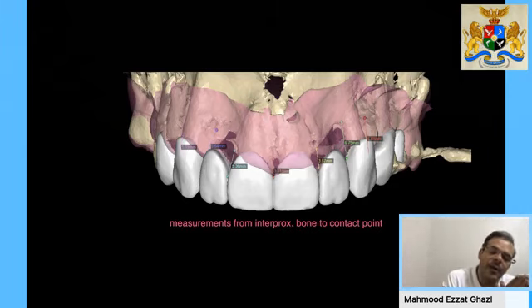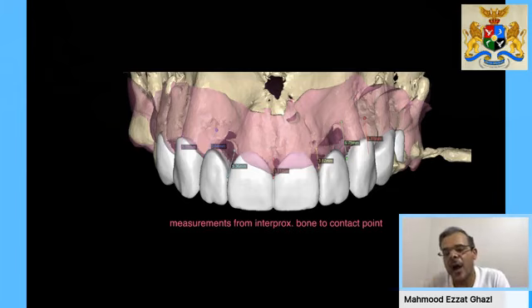according to if I'm going to be able to regenerate the papilla or not. I'm going to use an FP1 prosthesis, so my implant positions are going to be in such a way, or am I going to go for a hybrid prosthesis, so my implant positions are going to be totally different. So here we decided that we were going to go for an FP1 prosthesis. Of course, this would have been impossible for us to pre-plan unless we had all this information on one platform.